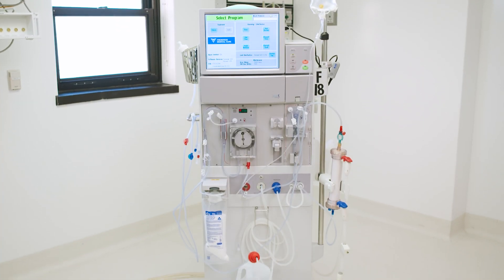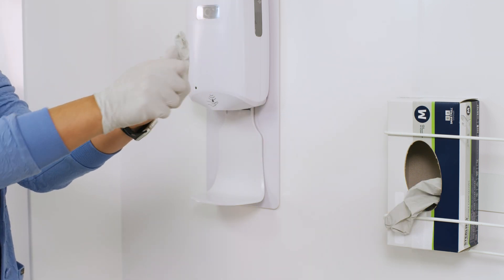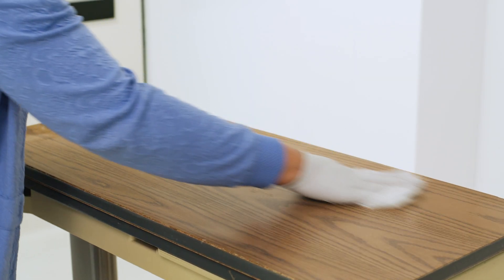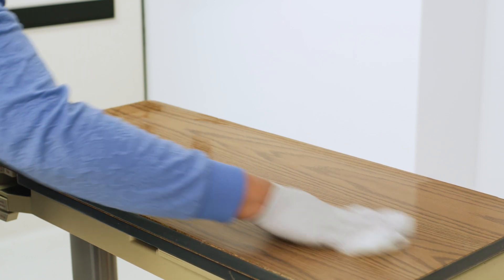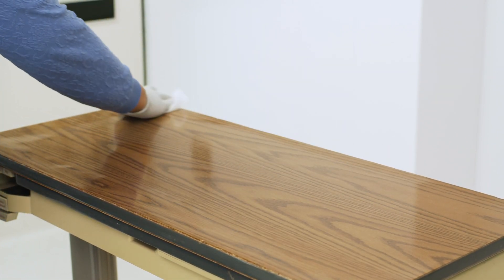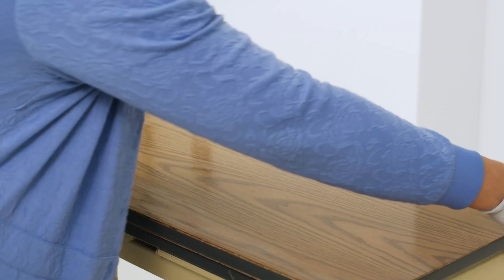First, we'll prep the machine for disinfection. Start with hand hygiene and donning a clean pair of gloves. Next, wipe down a nearby surface with disinfecting wipes where you can place your supplies for easy access during the disinfection process. The entire surface should be visibly wet with disinfectant for the recommended length of time per the manufacturer's label instructions.